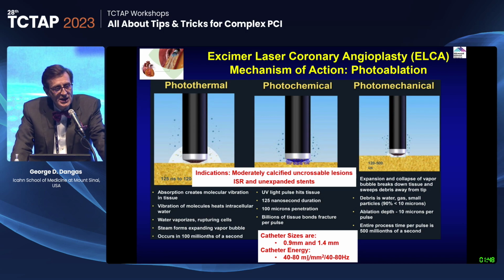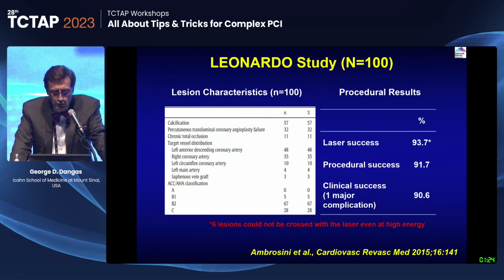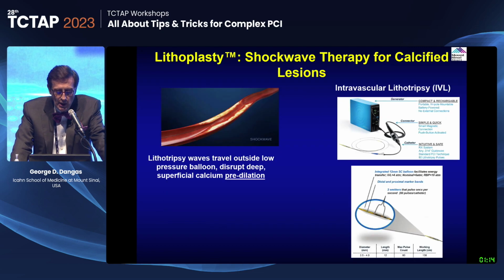Actually, there's a new laser coming up covered with a sheath in order to allow a little bit more control of this micro-explosion, so you can inject some dye through the dedicated sheath around the laser and activate. Therefore, the bubbles can be contained inside that sheath. To be continued about that. And there are some studies about this technique, which is a little difficult to study because not only is it off-label for the FDA, but also potentially dangerous to study.